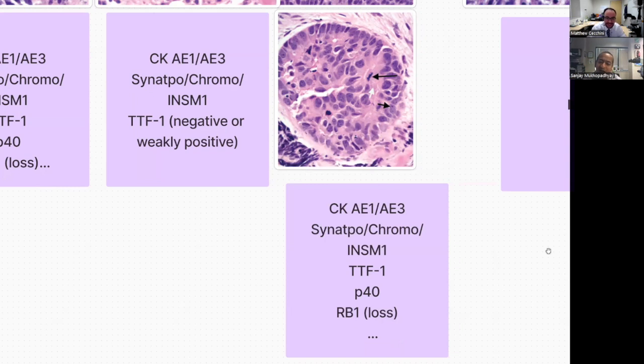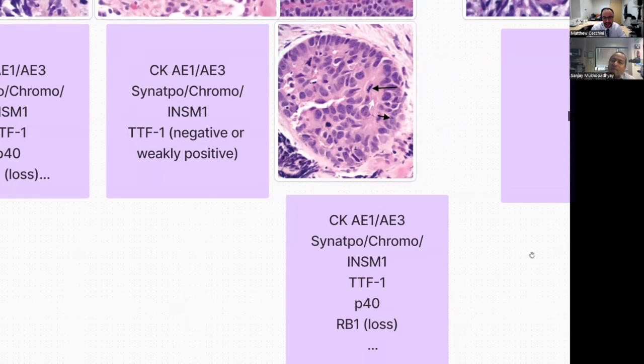What do you think about that kind of a case where it has both? Ultimately there's some you just don't know. My approach in the small biopsy scenario is to be a bit conservative and outline my uncertainty in a comment. Sometimes these things are more clear on the resection. If there's a clear adenocarcinoma component, then it's maybe just an adenocarcinoma with some neuroendocrine differentiation, or there are other areas that are more classic large cell, and sometimes that helps. That's what I do.